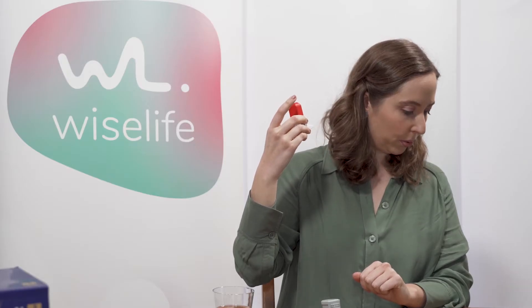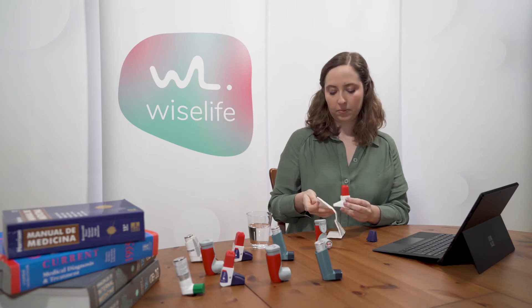Exhale slowly and gently. Wait at least 30 seconds before repeating the activation of the device.